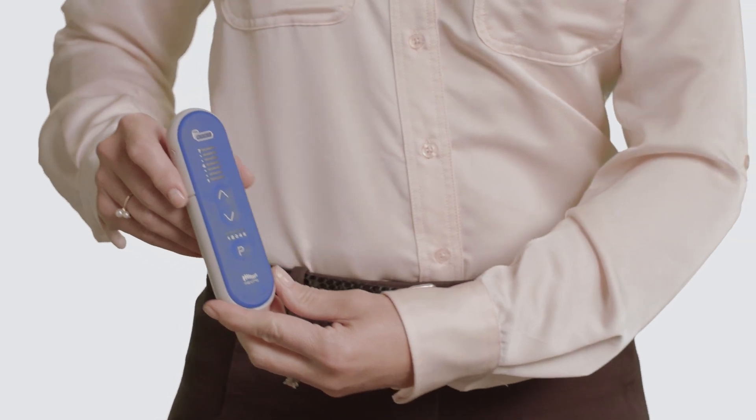If the impedance check was unsuccessful, you will hear three short beeps. This indicates the remote may be too far from the device. Move the remote closer to the device and press the up arrow once to rerun the impedance check.